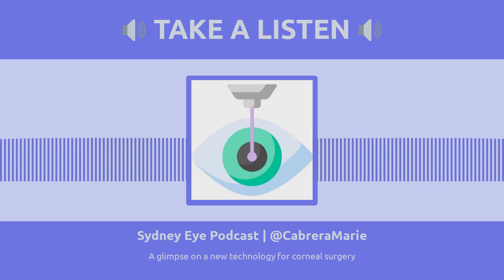Sounds like a very quick procedure. Yes, very, very quick. So far, we have experimented on an 8mm circular patch. So we got a hole around this 8mm in diameter, and we've also tried an oval patch, 4x6mm, so oval shaped patch. We have a laser footprint of about 1mm diameter.